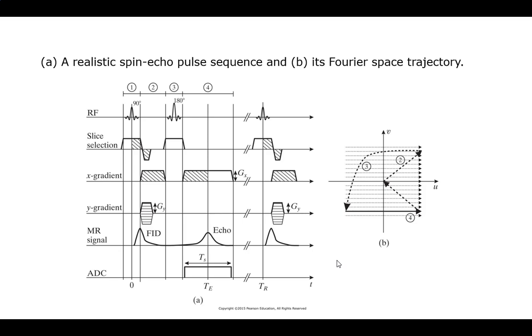Since I'm about to do a flip, I'm only going to move to the right in X. But I could go up, I could go down. It depends where I want to do the readout. If I'm doing the readout on the bottom, I go up. If I'm going to do the readout on the top, I go down. So that's what's determining this location. The further up, the further up, the further down, the further down. Good? All right, I'm doing this during that FID. It's mostly died away. This is the ideal time to give the 180 kick. I have to select Z so that I don't excite the other layers and cause noise.